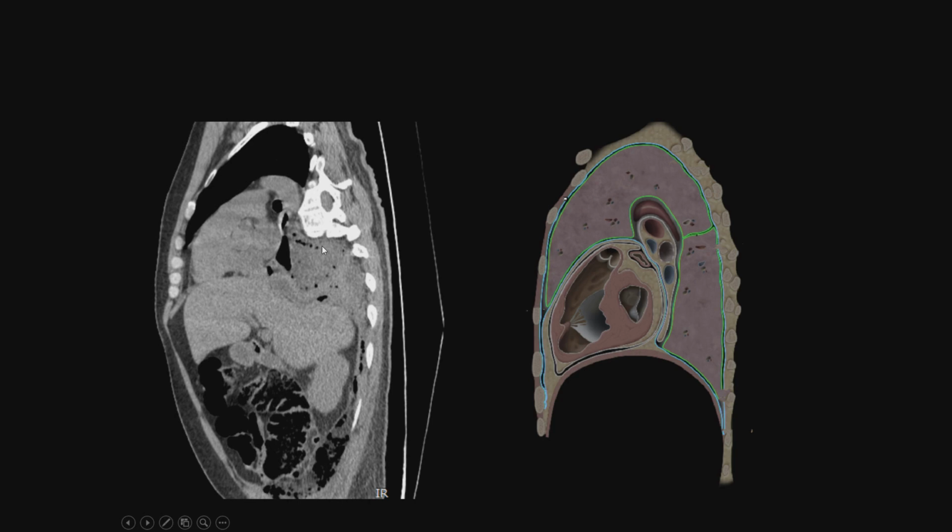The retrocrural space, which is this space over here, connects the thoracic cavity with the retroperitoneum. In fact, this fact, in association with the different pressures that the thorax and the abdomen have, as well as the lymph flow direction of these different places, explains the development of empyemas when they're followed by abdominal infections. So, comparing this sagittal CT, as I told you, you can see how this infection went to the empyema and made the thoracic infection.